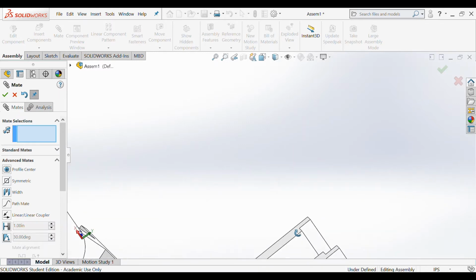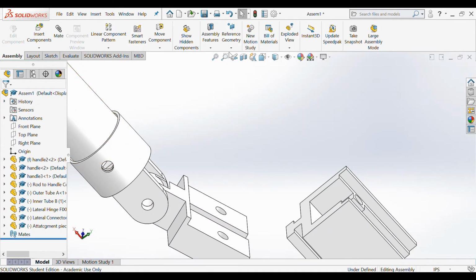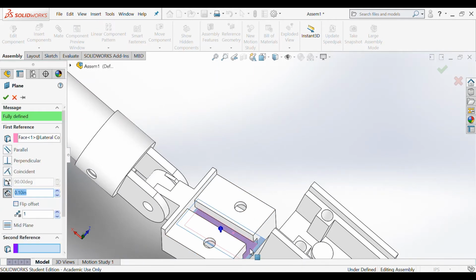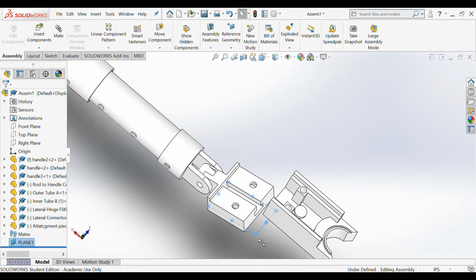And now I'm going to make a reference plane. I'm going to click on this bottom surface right there, and I'm going to make the distance from the plane to that surface 0. I will explain why we're making this plane in just a second. We're going to extend it out a little bit.